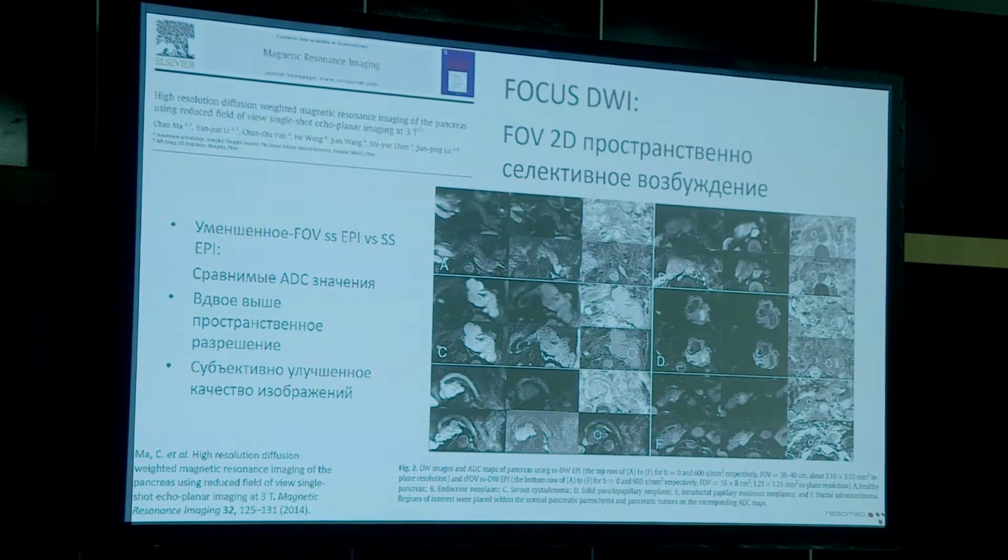This was analyzed scientifically, and in this publication, the technique was compared against the standard single-shot EPI in patients with pancreatic pathology. And the authors found that there is a twice better spatial resolution and subjectively improved image quality for the reduced field of view approach over the standard single-shot EPI sequence.